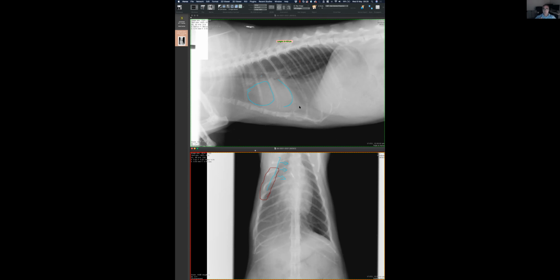That is what we are doing, which I think is a lot of fun: hypothesis testing. Makes sense? We bring a hypothesis and we run with it as far as we can. Then there's a point where we find a block, and we need to start again. So we are still with the idea of, and I can even bring more stuff, the separation of the lung from the wall. I think there is a mild mediastinal shift to the left. And I also think that the diaphragm looks abnormal. It's very subtle, but it's flat.